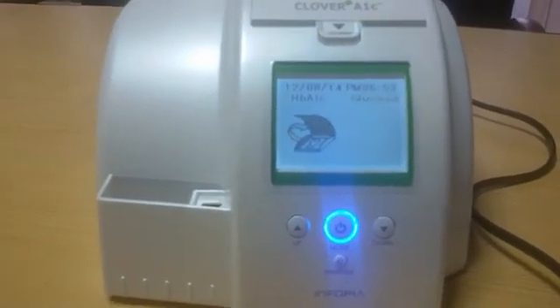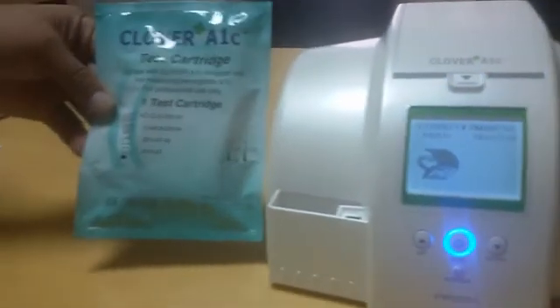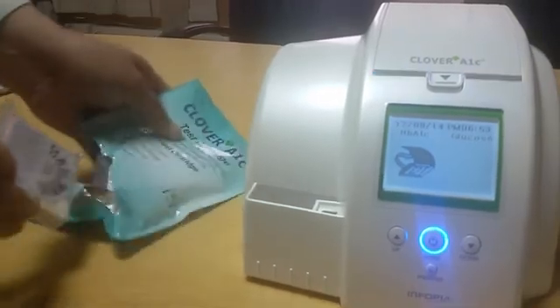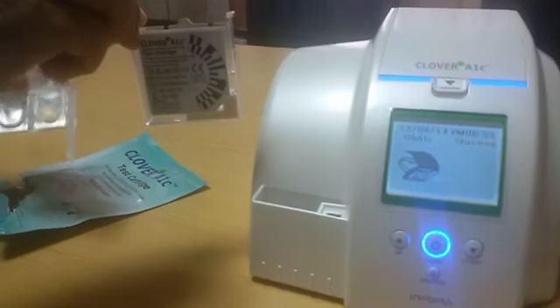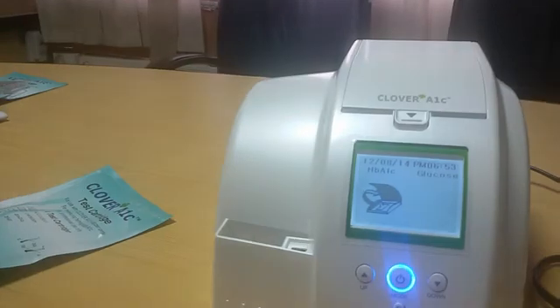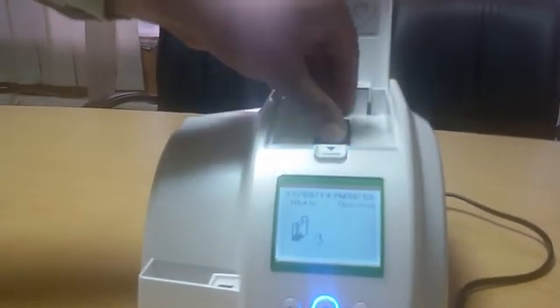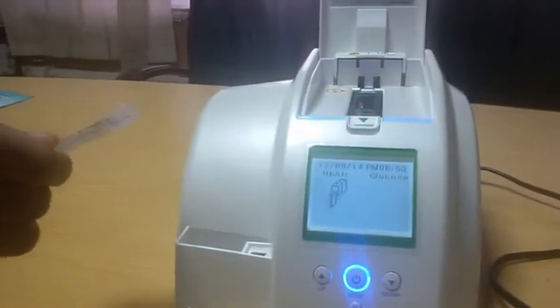Once the display shows the open cover icon, you may begin the test. Open a new test cartridge pack — there are two parts: the blank cartridge and the reagent pack. Open the cover and insert the blank cartridge, then gently shake the reagent pack four to five times.